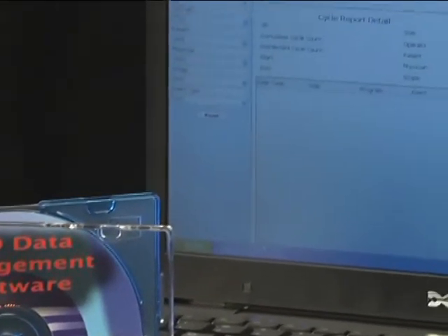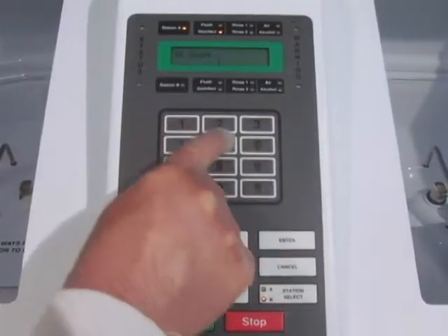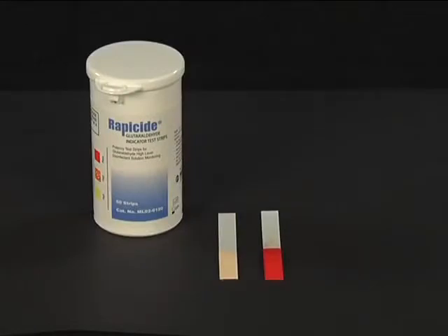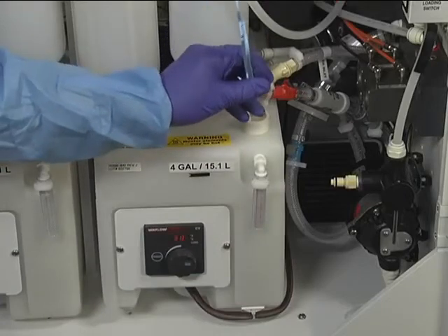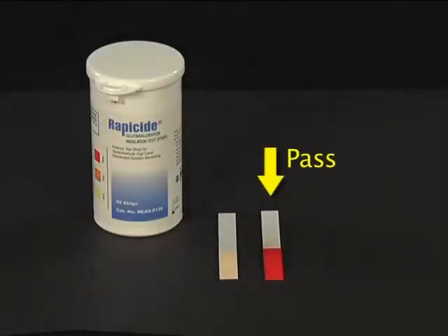If using DSD data management, the same data must be entered as for the printer. Use the numeric keypad to enter the appropriate ID data. Press the Start key. DSD-201 units purchased after June 2008 or older units with software version 7.0 will prompt you 'HLD test pass'; prior versions of software will prompt 'LCG test pass.' The disinfectant in the reservoir should be checked prior to each reprocessing cycle. If the test strip indicates a pass, press Enter to begin the cycle.